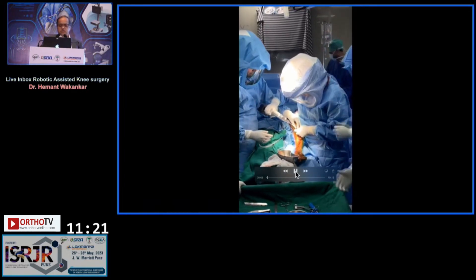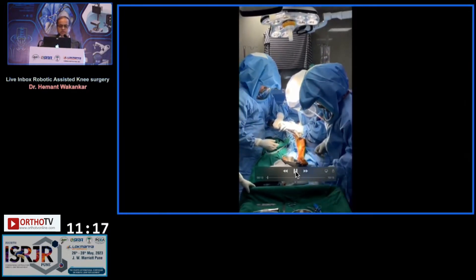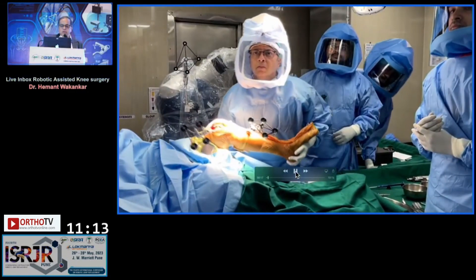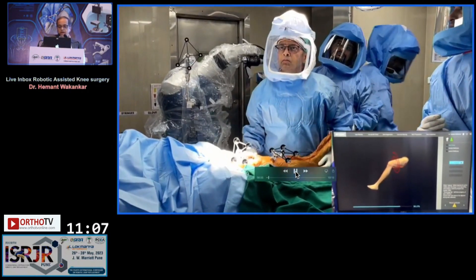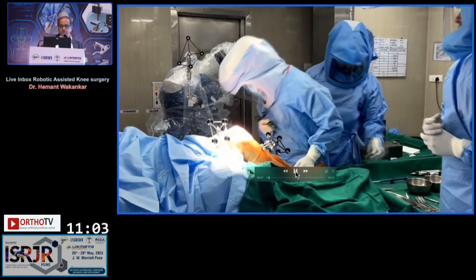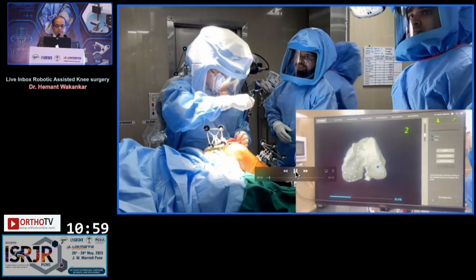It starts off with putting the pins on the tibial side, where we usually put them about two inches below the tibial tuberosity. On the femoral side, I put the pins antero-medially. Then I put it through the range of motion for hip registration. This is what I see on the screen, and in a matter of 15 seconds that is done. Next step is obviously all the bony landmarks — registration of the ankle and the knee.